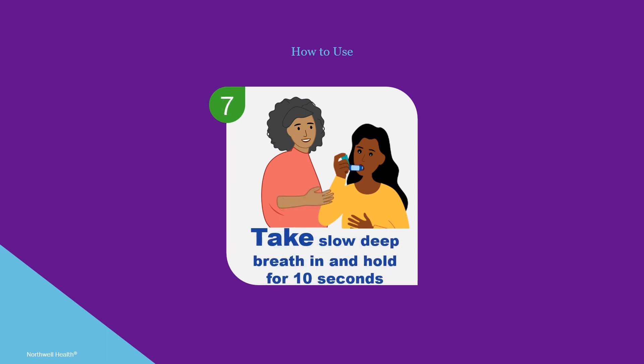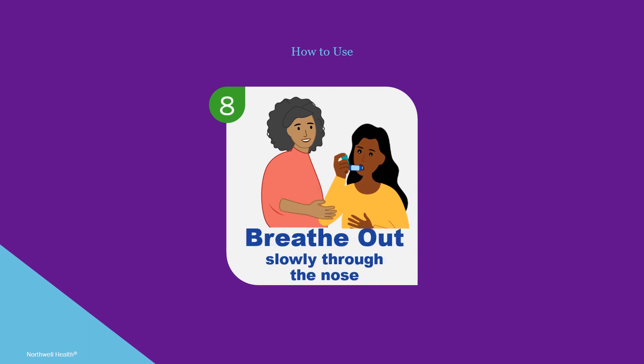Right away, take a slow deep breath in and hold your breath for 10 seconds. Make sure to count slowly: 1001, 1002, up to 1010. If the spacer makes a whistling sound, you're breathing in too fast — slow down.